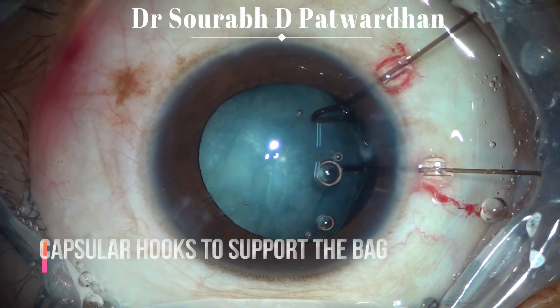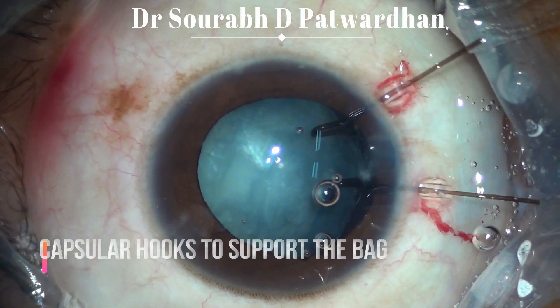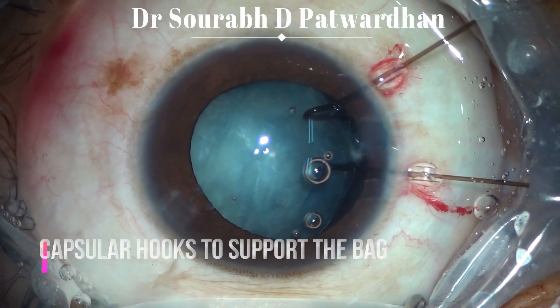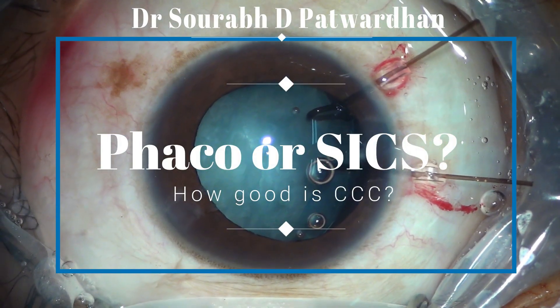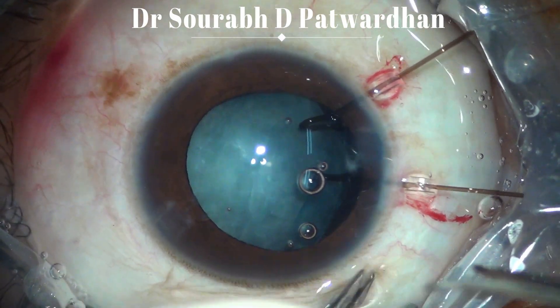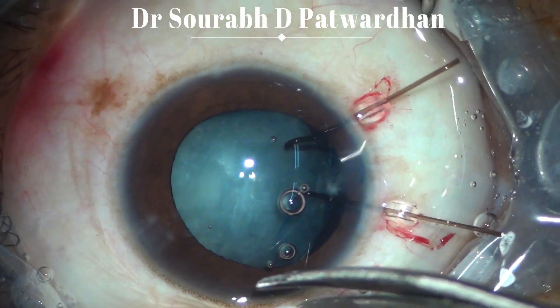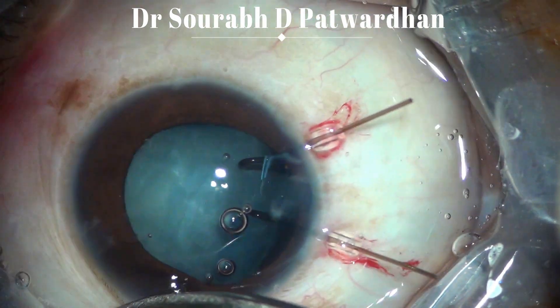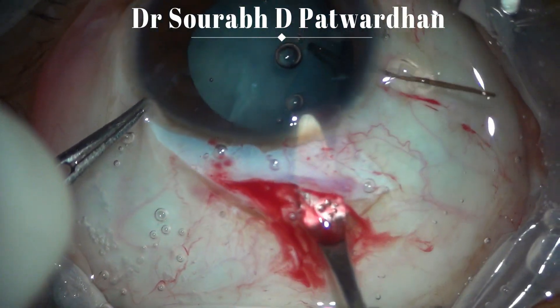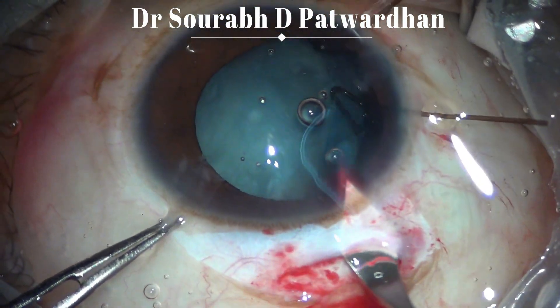I made the scleral tunnel. With small incision cataract surgery we are not raising the pressure in the anterior chamber as much as in phacoemulsification. Also, we do not need frequent nucleus handling or nuclear rotations as in phacoemulsification. As the fluid going in is less, there is less chance of fluid deviation and the vitreous being pushed up. So if you are not sure of your capsulorhexis, you can always use small incision cataract surgery to remove the nucleus.